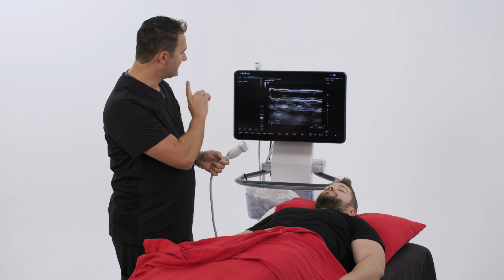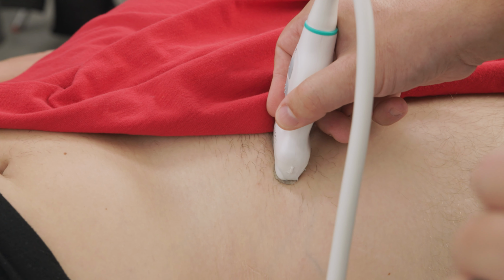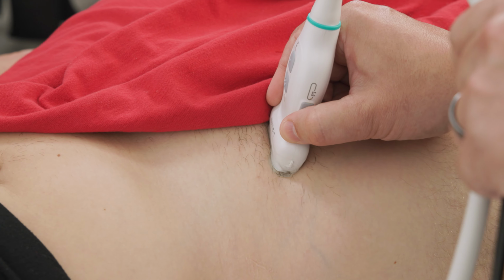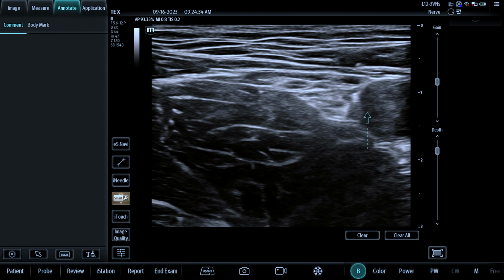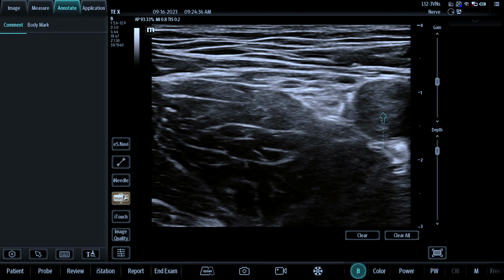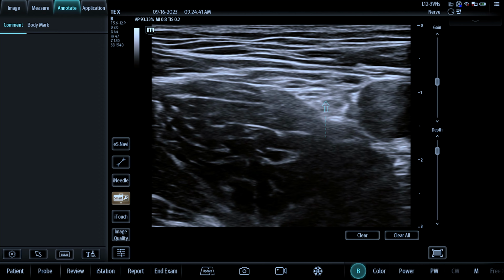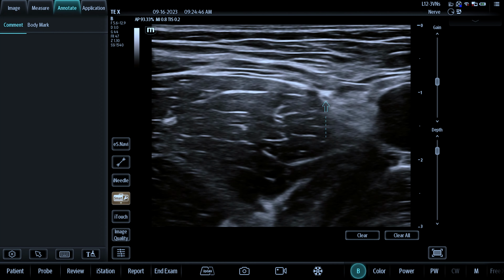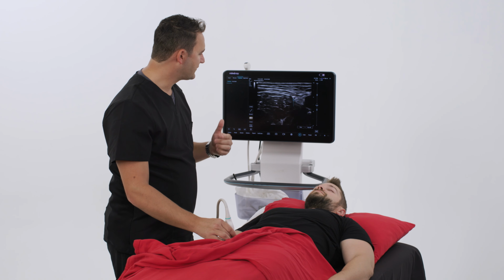So on the screen, the left side is going to be lateral, the right side is going to be medial. We talked about home base earlier on and in our other videos. Home base for this is also going to be our femoral nerve block. It's easy to find. Put the probe in the inguinal crease, identify your femoral artery, femoral nerve. The other thing you should identify is going to be the ASIS. We want to make sure that we're caudad to the ASIS because if you're above the ASIS, you're not going to find the lateral femorocutaneous nerve as well.